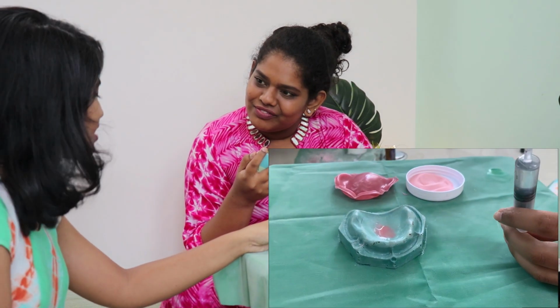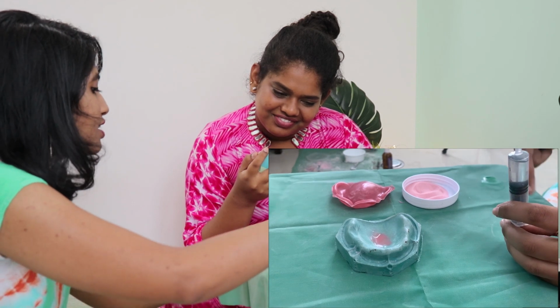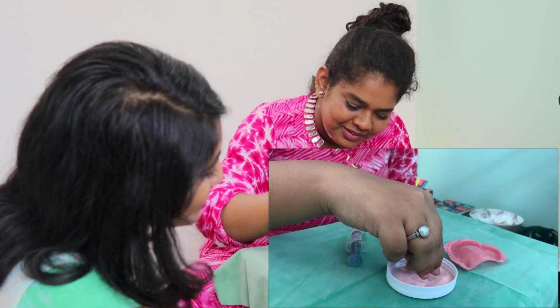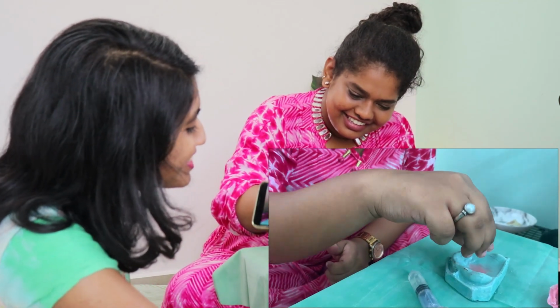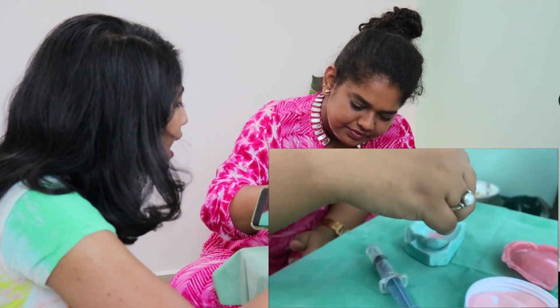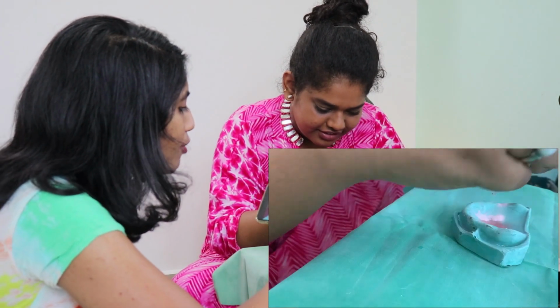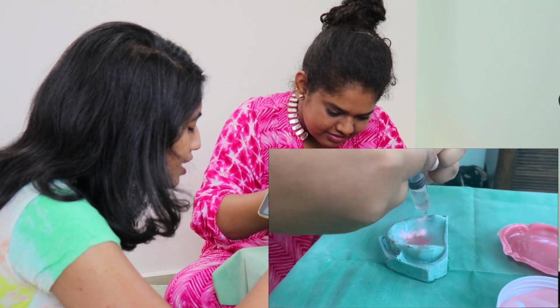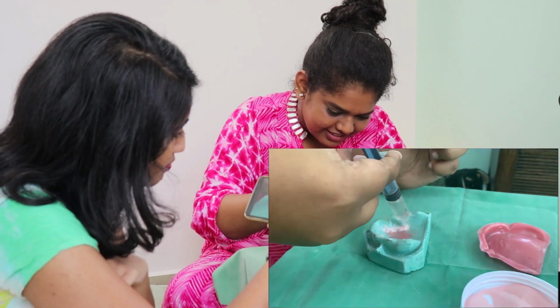That's the thing. But I can't expect you to do that, because you are putting it in the hand. See, you should make sure you add the powder and then immediately add the liquid, and cover up all the area where there is liquid. Okay, got it.